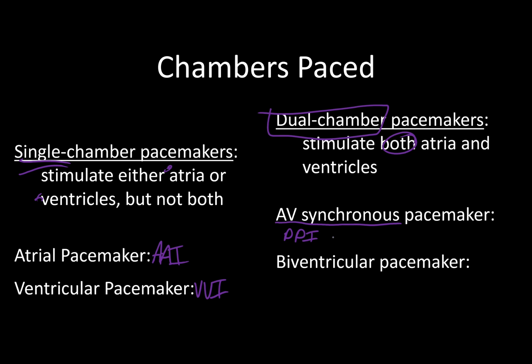The idea is that you maintain cadence between the atria and the ventricles so that the pacemaker is completely in control. It says, I pace the atria now, and then after an appropriate amount of time, I pace the ventricle to, again, artificially create an appropriate heart rate, heart rhythm, things of that nature.